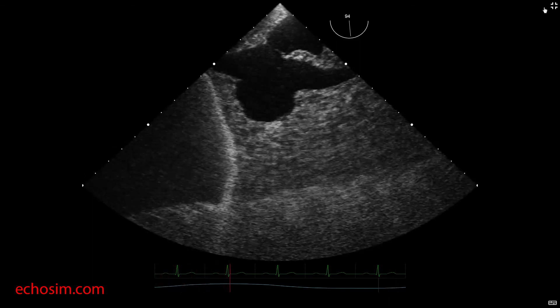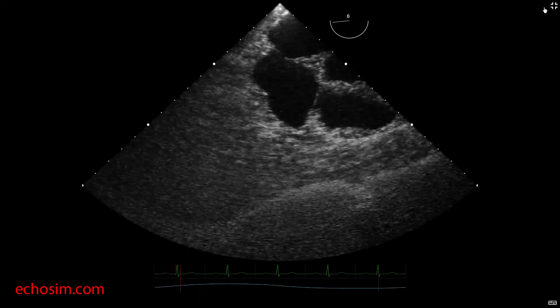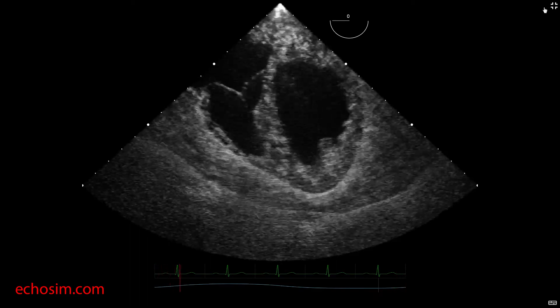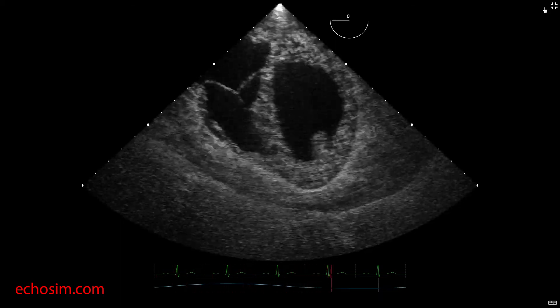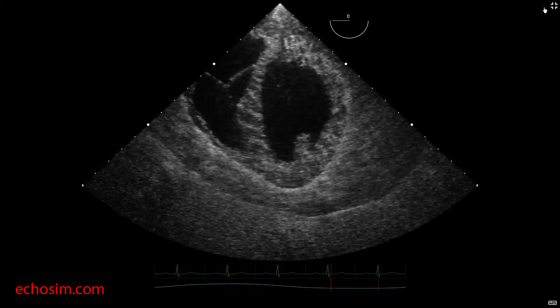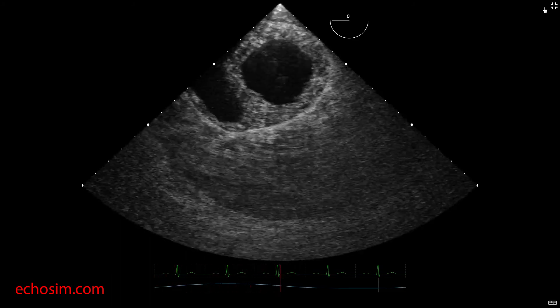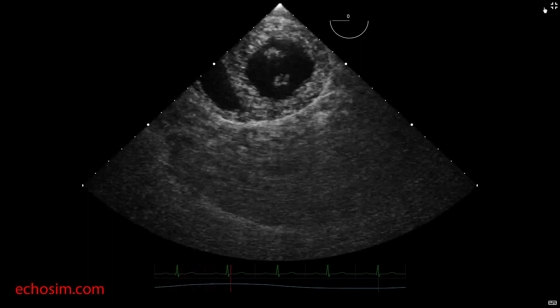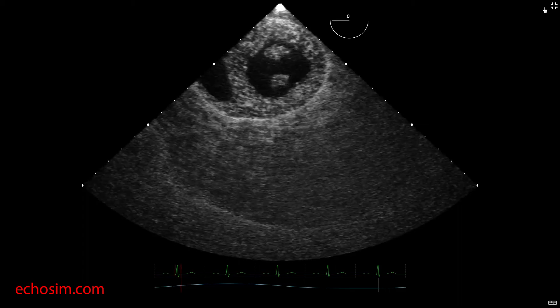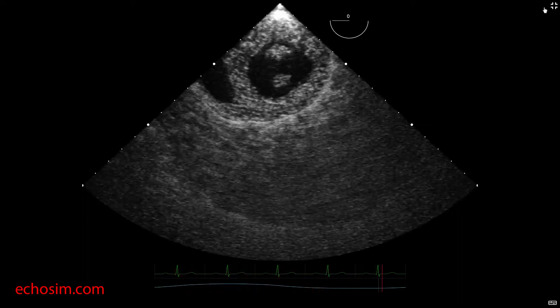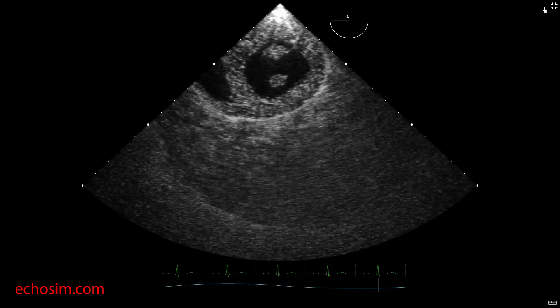The final view is the transgastric mid-short axis view. From the mid-esophagus, the probe is advanced to the junction of the distal esophagus and the stomach, evident by the presence of the coronary sinus, which appears as a linear chamber at the junction of the left atrium and left ventricle and can be seen emptying into the right atrium. The probe is then advanced further into the stomach, passing the mitral valve and stopping at the level of the papillary muscles. Some degree of anteflexion with the big wheel may be required to keep the probe crystal in contact with the diaphragmatic undersurface. The inferior wall on the diaphragmatic surface will appear closest to the probe in the near field. This view is important in evaluating tamponade, preload, afterload, ejection fraction, and regional wall motion abnormalities.